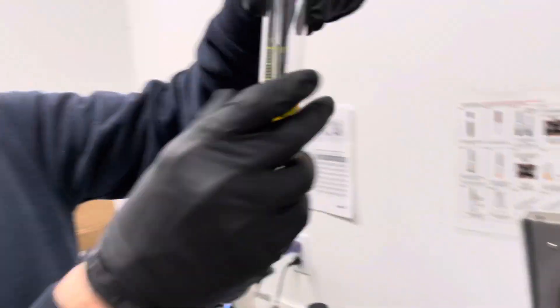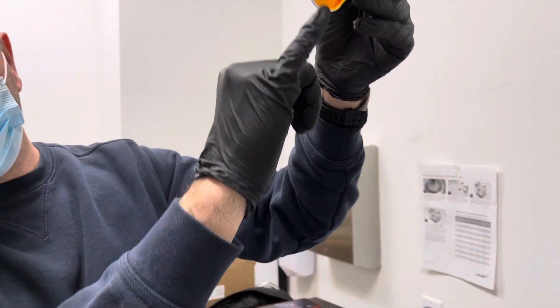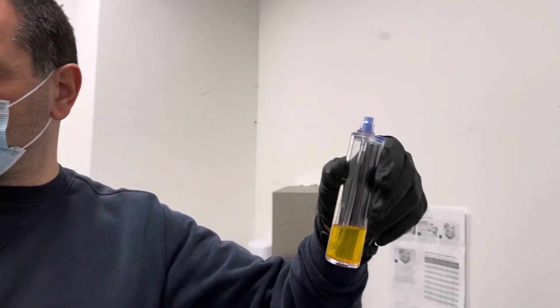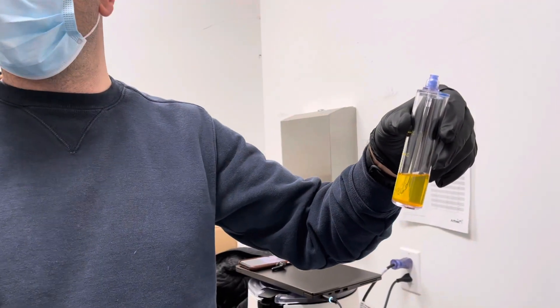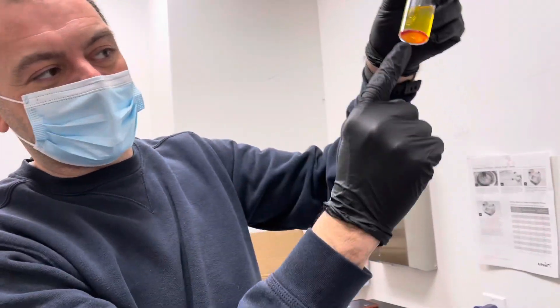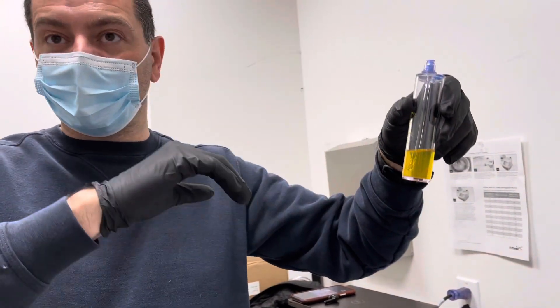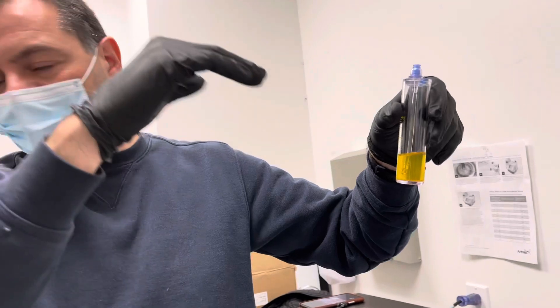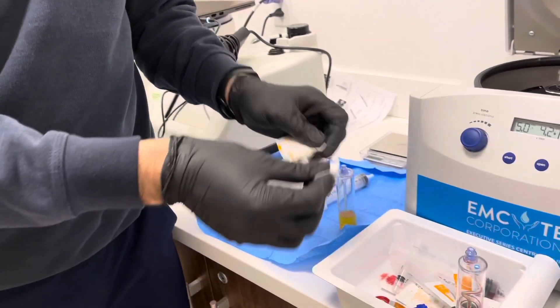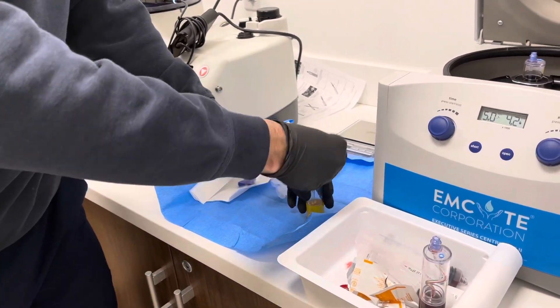What we're looking at here is platelet-poor plasma and platelets. From all the blood, all we really wanted was that stuff at the bottom there. We're going to use some of the liquid as the vehicle to inject it. In this case we're going to do five cc's — ultimately whether you do five, seven, or ten, you're still getting all of the platelets, so it doesn't affect the dose being delivered. What is affected is the concentration: a small amount gives higher concentration, a large amount gives lower concentration. In this instance we worked out we're going to put two into the cuff and three into the joint space.